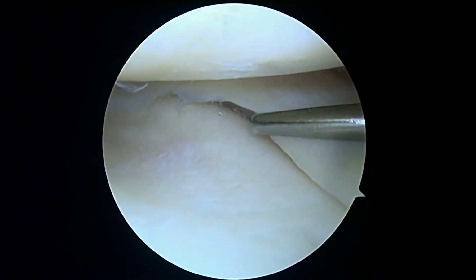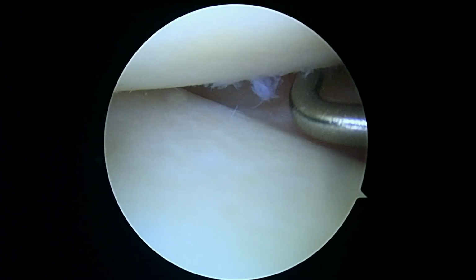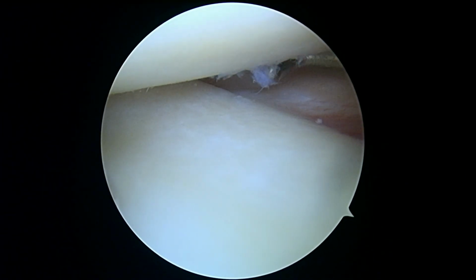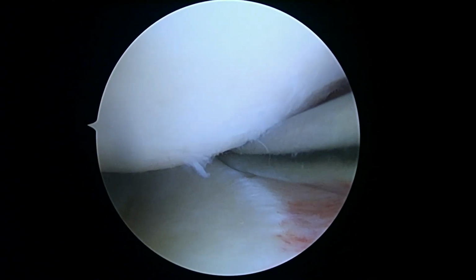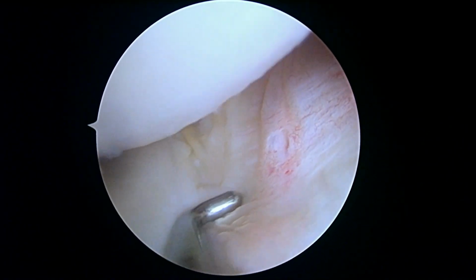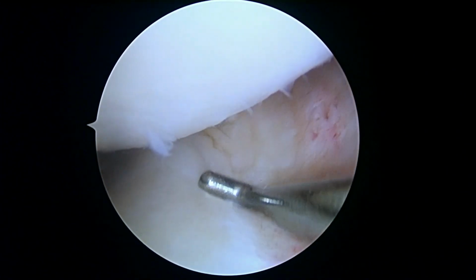We get into the body of the meniscus where there was a little bit of concern about tearing. And while we keep our scope pointing medially here, we can look at the meniscocapsular junction. It looks good. I'm going to leave my probe there and rotate around. That gives me a look around the side here. And so I wonder if that wasn't read as maybe a little bit of a tear right here, right where my probe is, but that looks like it's solidly attached. And we're going to inject that area with PRP in a minute.